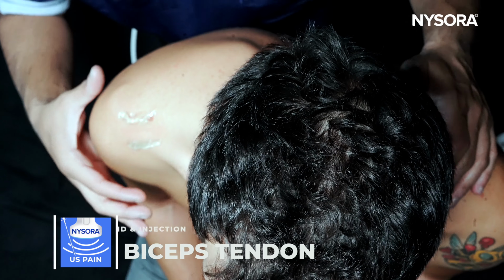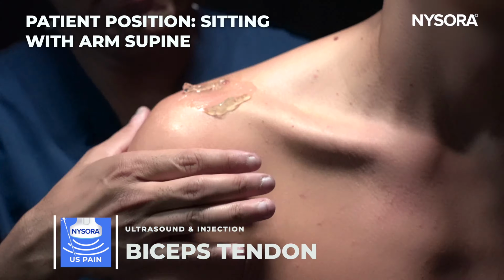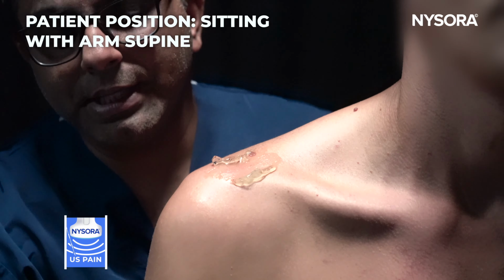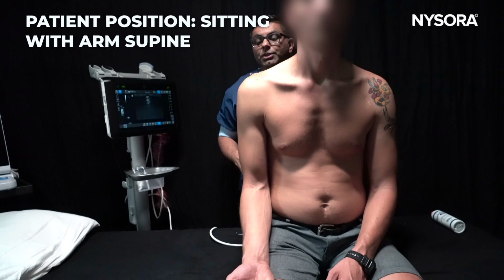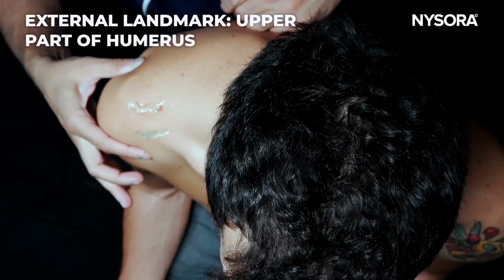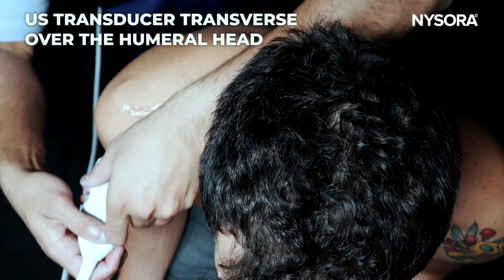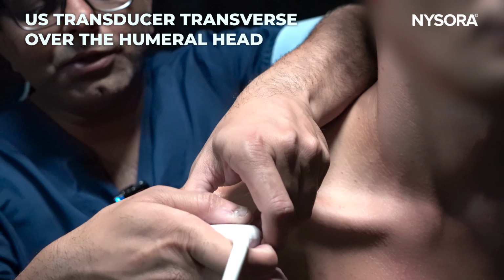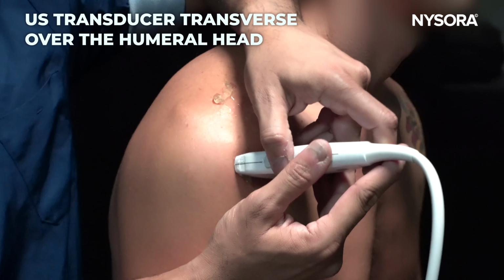I'm going to show you the bicep tendon peritendinous sheath injection. To perform the procedure, the patient will be sitting with the arm in a supine or neutral position. You will feel for the upper part of the humerus, and you will bring the ultrasound probe, resting it on top of the humeral head, looking for the tuberosities.